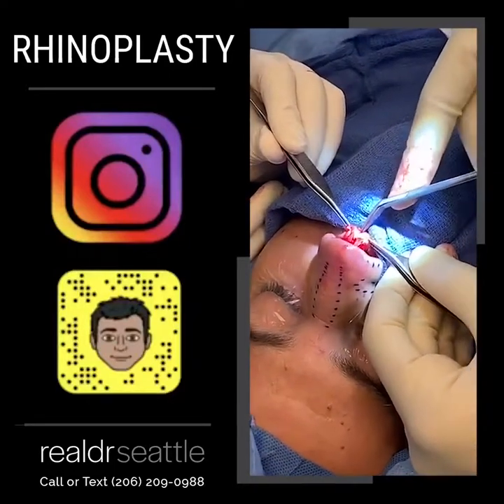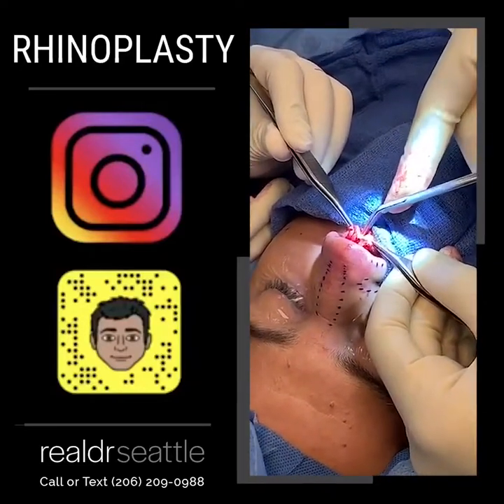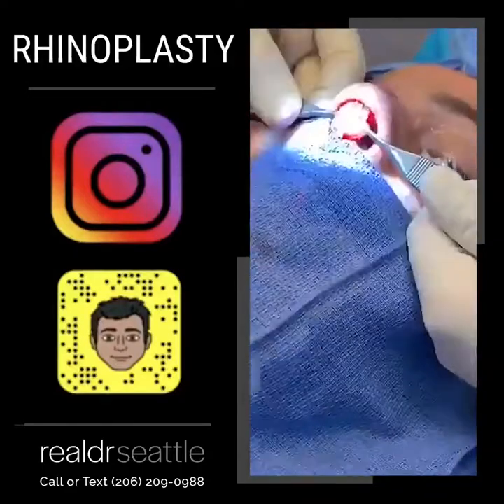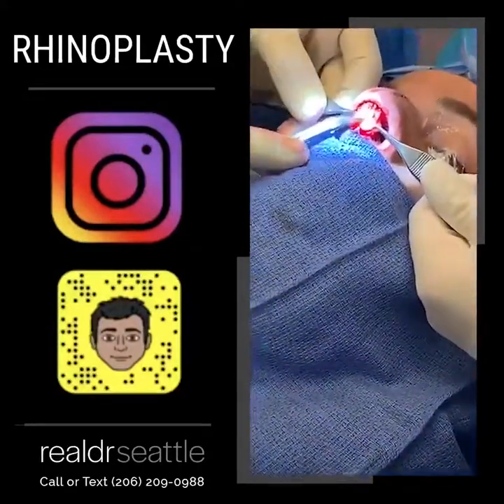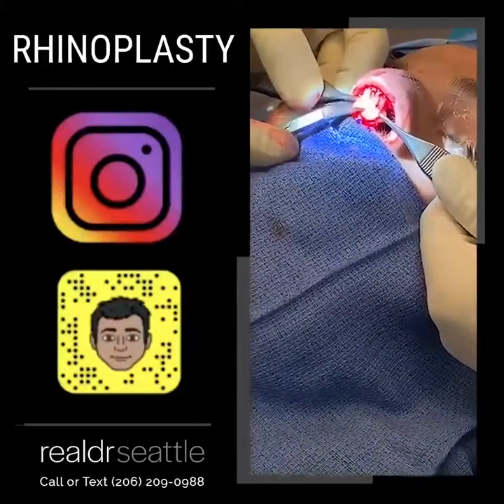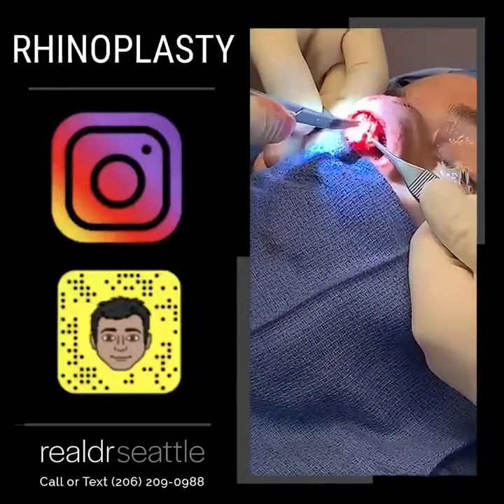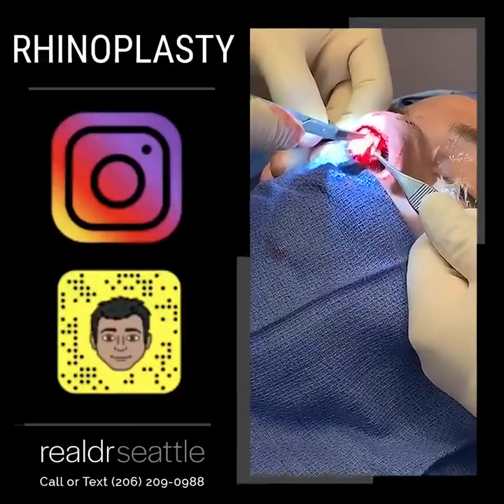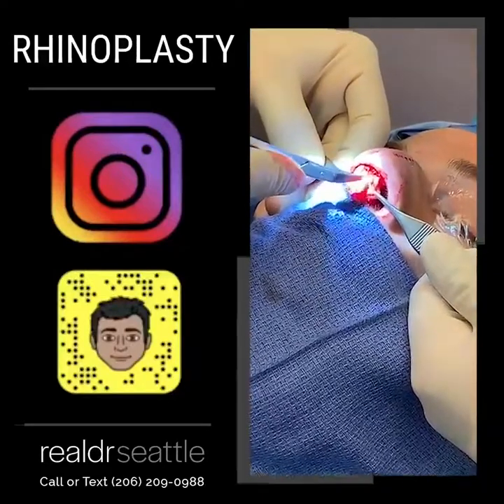We're gently separating it without making a hole anywhere. This is really, really challenging. My assistants are retracting, and we're trying to get to the septum. The septum is right here. Do you guys see how hard this is to see and feel? Rhinoplasty is a thinking man's surgery — a surgery that deserves extreme focus, dedication, and respect.